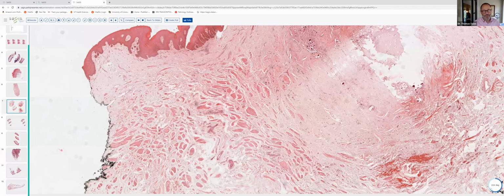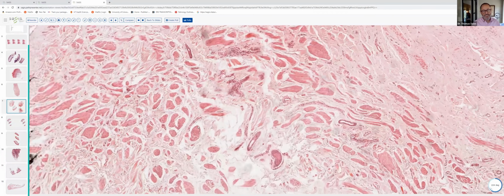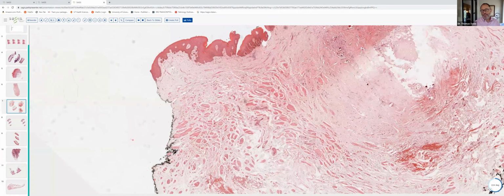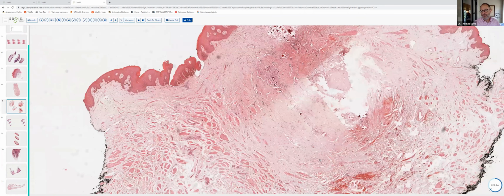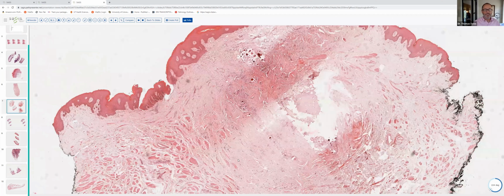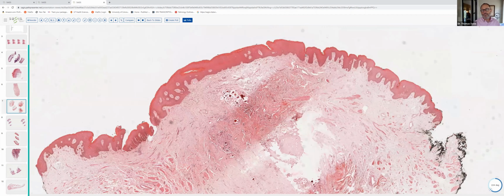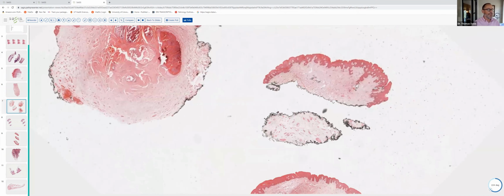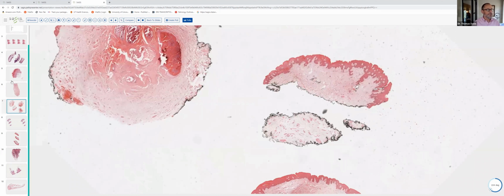This was actually from the scrotum, and one can see several smooth muscle bundles in the dermis, which is very characteristic for genital skin. Sometimes you will see apocrine glands as well, and frequently the epidermis is a little papillated as well. So genital skin. Okay, moving on to slide number 6.